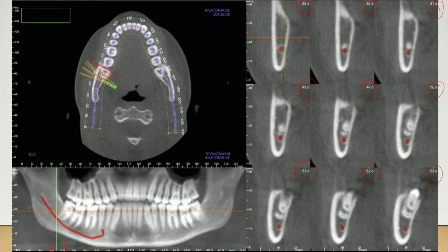The important thing is actually that this slice is your panoramic curve, and that panoramic curve has to be mapped so it corresponds to your arch. Why? Because if, for example, that curve was somewhere out here and we took a slice this way, then you're not going to get a slice parallel to your jaw, okay? So we need this slice basically straight up and down, but also it has to be 90 degrees to the parabola of your arch, okay?